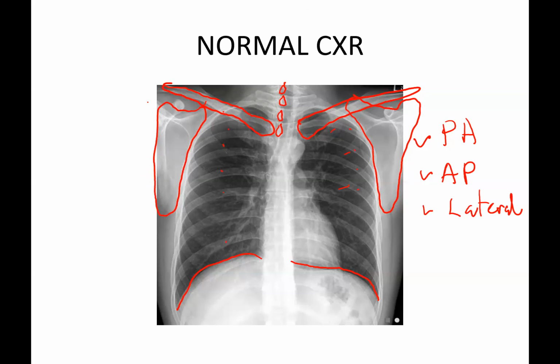However, there are certain diseases where a chest x-ray will show a normal finding even though the patient has the disease. So it is important to know that not all chest pathologies are visible on chest x-ray.